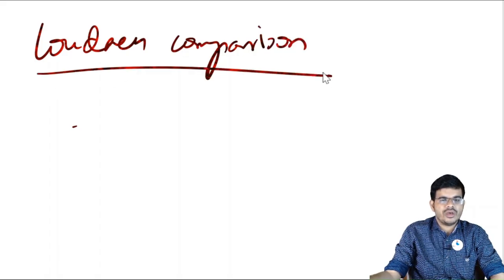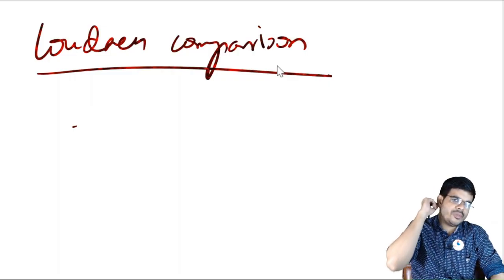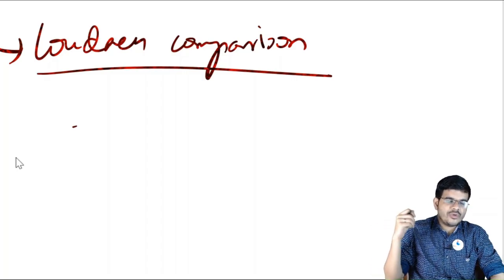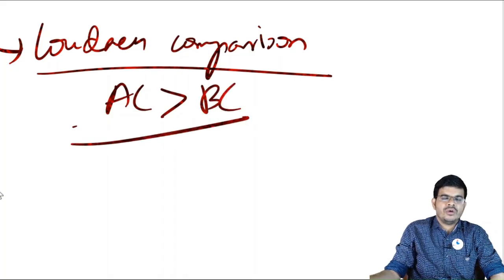After keeping it there, you compare the sound heard with the sound heard while keeping it on the mastoid process. Then we check if air conduction is better than bone conduction. If the sound is heard better when kept in front of the external auditory canal, it means air conduction is better than bone conduction.